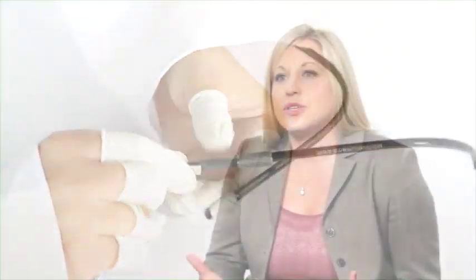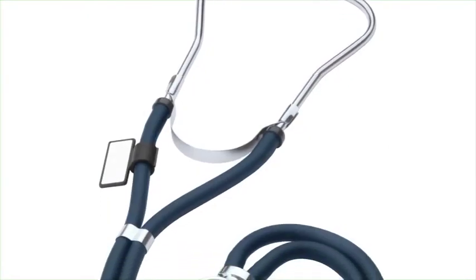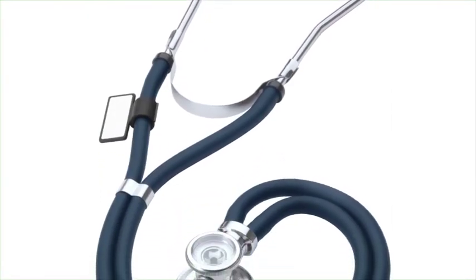Then, we addressed the issues with the durability and the tubing in the original models. We incorporated our non-stick, crack-resistant tubing, as well as made the overall length of the stethoscope longer. This allowed for more practitioner comfort and personal space.